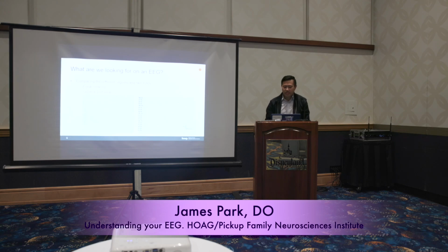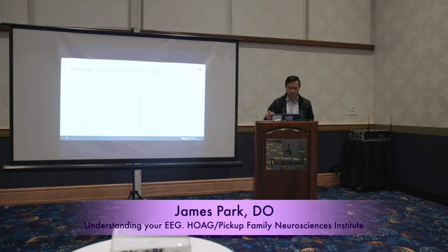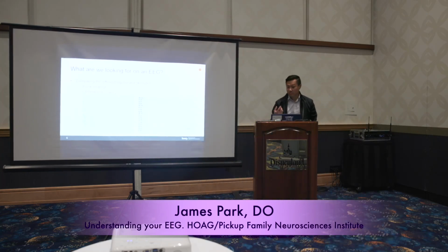So what exactly are we looking for on the EEG? Like I said, comparing the different regions and the two different sides. For instance, there may be focal slowing. As you see in the first picture here, I don't know if you see my arrows. On the bottom of the page, you'll see it's a little bit slower here than in here, right? That suggests that region of the brain has some dysfunction there. That can sometimes be a hint for where things could be going on. The second picture is more of a generalized slowing. Sometimes when patients are in the hospital, confused, or on medications, you may see more generalized slowing as well.